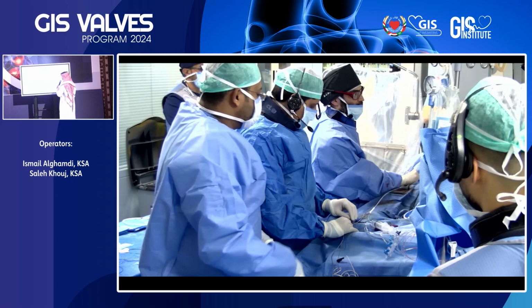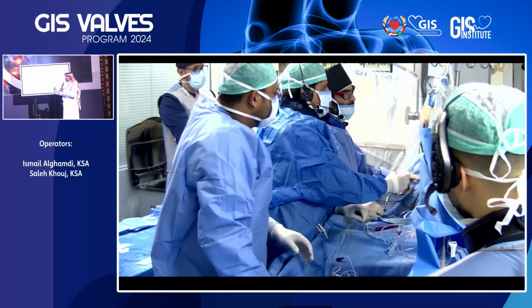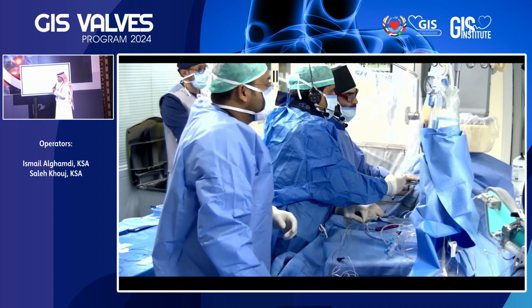But if you consider this 82, this is at the measurement between the 29 and 34. So if you take this measurement, you might be choosing either 29 or 34. But in those cases, you prefer to go with a smaller measurement, even though it's not the annulus measurement, it's more the intercommissural distance, which is a 29 millimeter CoreValve.